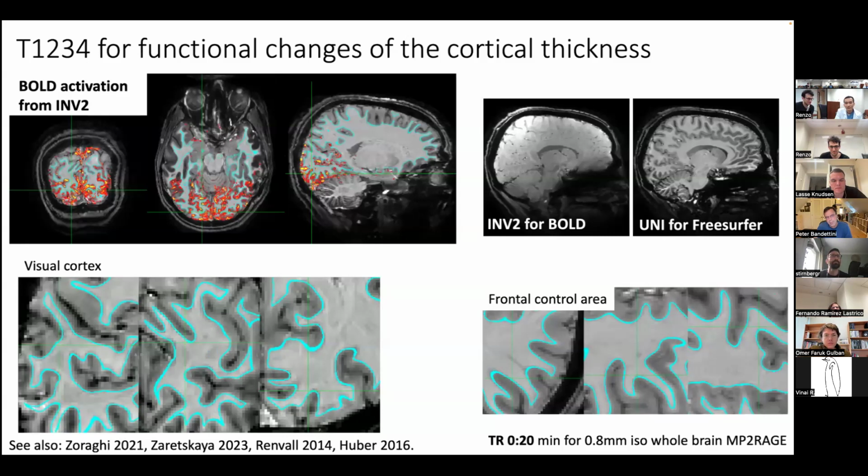You can grab the second inversion time as T2 star weighted BOLD, while grabbing the T2 star free T1 weighted images for activation-dependent structural analysis. In this analysis here, the FreeSurfer mostly detects a gray matter dilation at the white matter border. You can see here, they are small but consistent. Different to non-visual areas, like at the frontal cortex here, where you can get a feeling for the run-to-run surface location in inactivated areas.